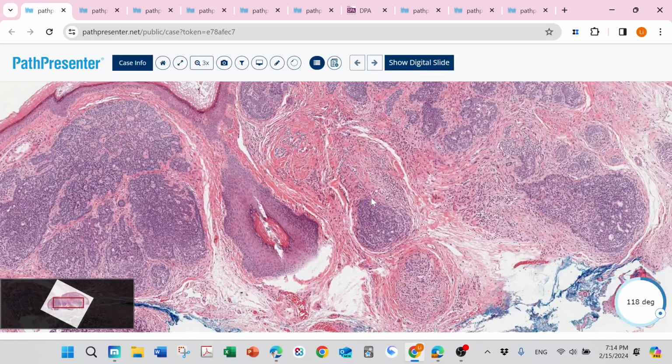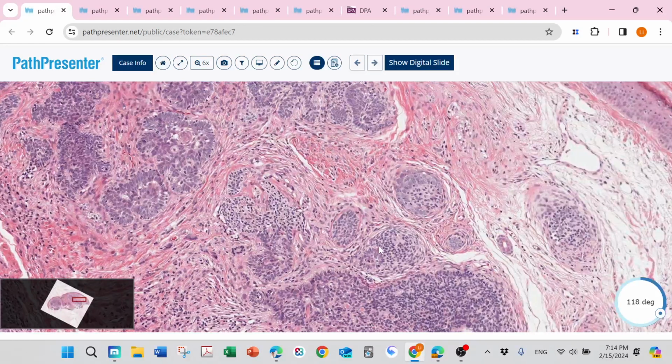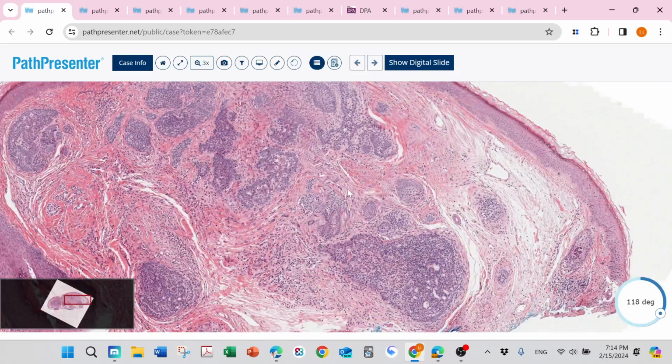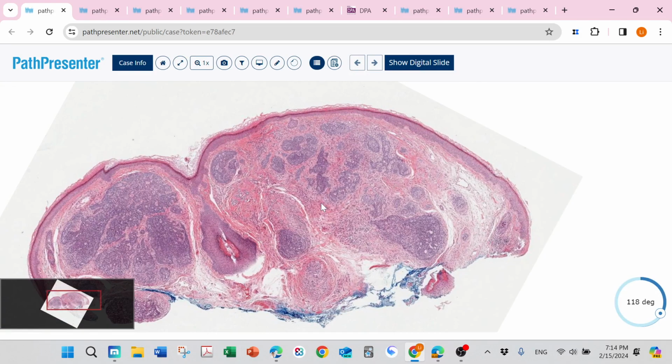Then we want to see our friend, the papillary mesenchymal body. This one is a really nice basaloid cell hugged by spindle fibroblast-like cells. And remember, we can do CK20 to highlight the passenger Merkel cells.